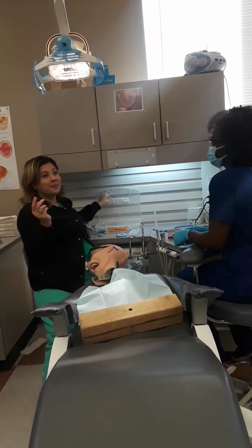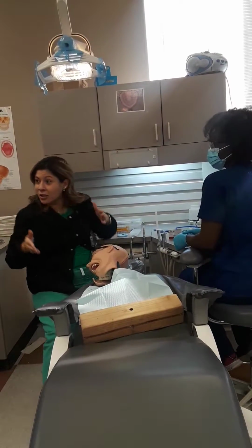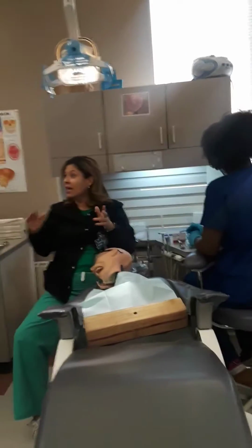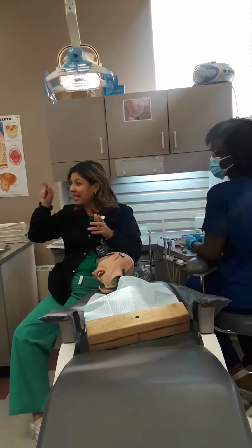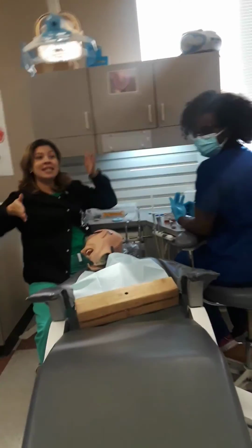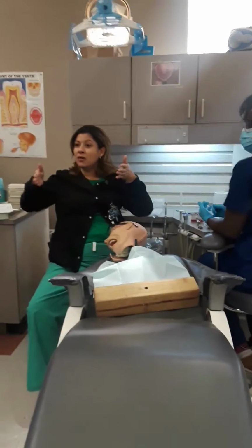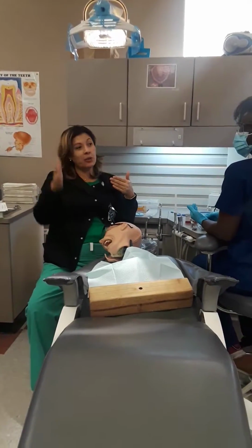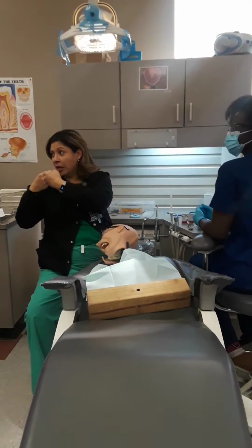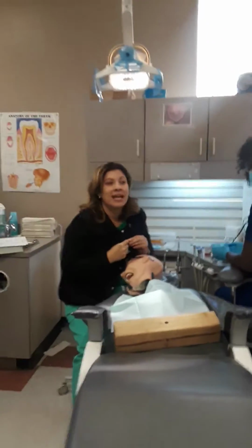What's missing though? If I use this matrix band, your mesial and distal, so your proximal surface, is missing from the tooth. I know you guys don't know what it means, but I will explain and draw, because I promise you'll get it, okay? Our mesial and distal, which means our right and left side of the tooth, is missing. So if I didn't have that strip in between, I would bond the teeth together, and then I'd have one big ginormous tooth.